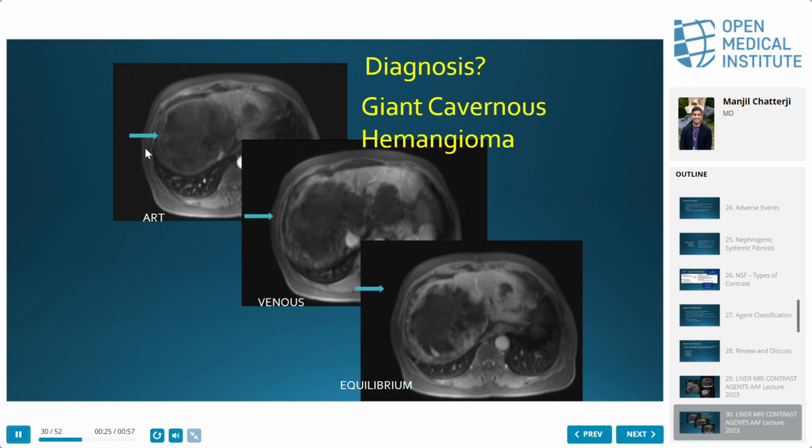If it were just these images, I would even say maybe it's a sarcoma met or something nasty, and this might go to biopsy, and biopsying hemangiomas is not a great experience. So contrast saves the day. In fact, some 80% of studies we do nowadays involve gadolinium. So it's essential, and even today, so many years later, we don't have an alternative, do we?